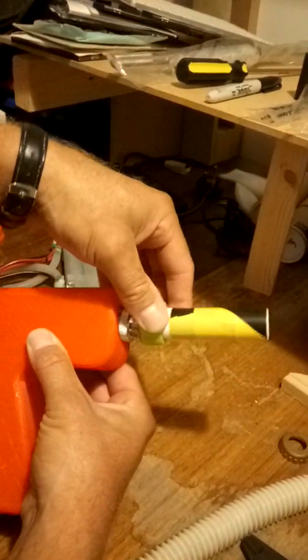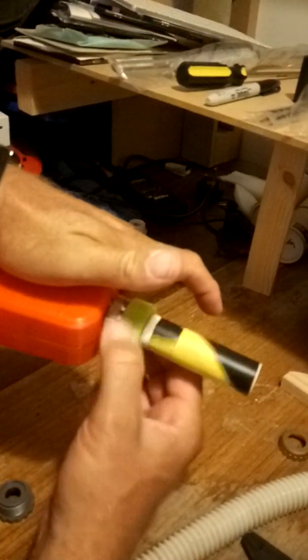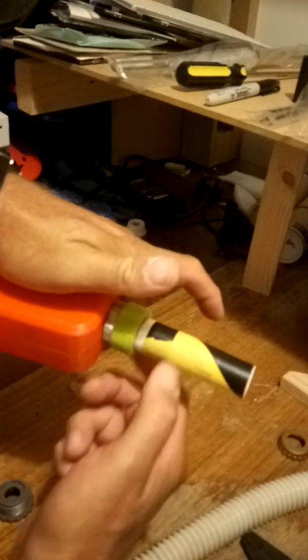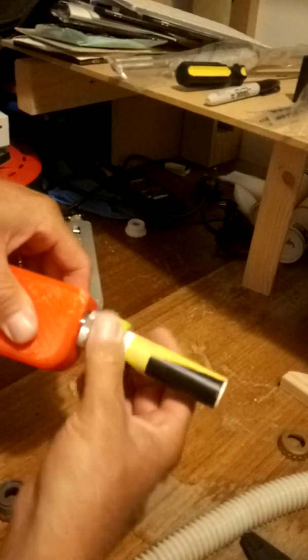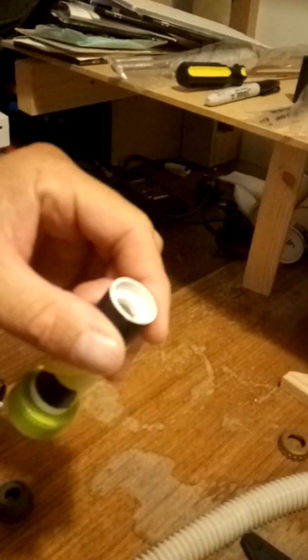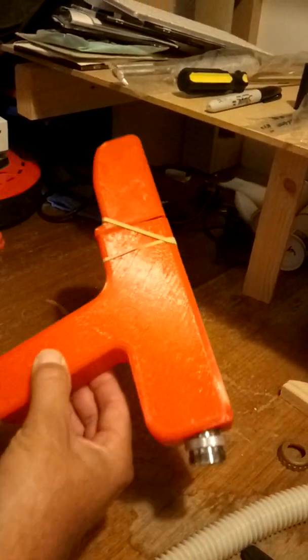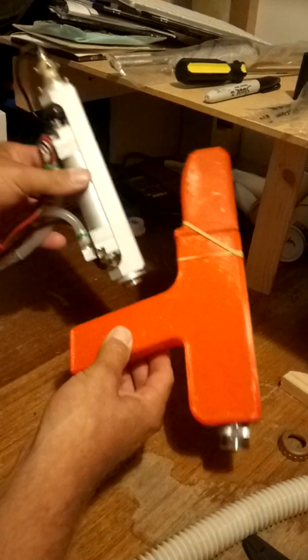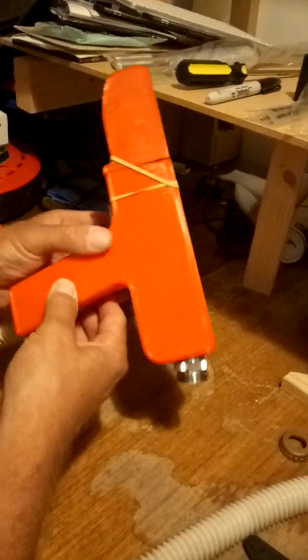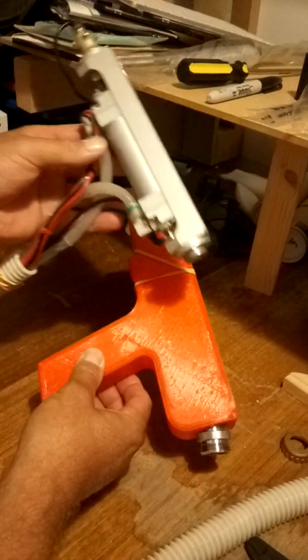There we go. Let's see if I can use my left hand instead of my right hand. And it's tight. There we go. This is prototype number 2 lens here, so we'll forget that for a minute, even though it's ready to work. So this handpiece then is the enclosure for this. Can you see what I mean? That goes in there like that now. So if you ignore the elastic bands, etc., that will be the handpiece.